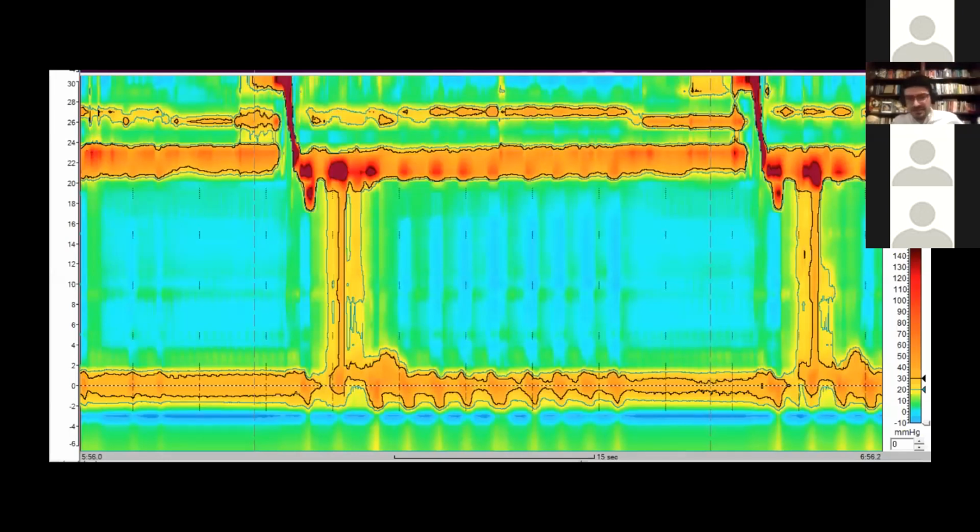This patient actually had, this is a post-op patient, not a myotomy post-op patient. This patient had a Nissen, and subsequently developed dysphagia. Dysphagia was not present in their preoperative assessment. They did have a normal manometry, but what happens if you take a rat and close off its esophagus, it will develop achalasia.